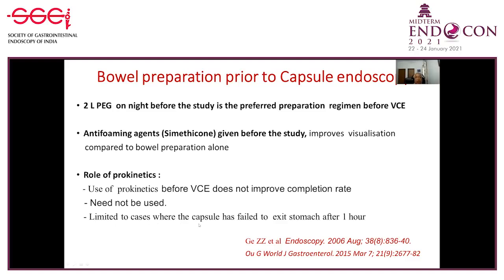It need only be used when the capsule has failed to exit the stomach after 1 hour. So at that time, it may be useful to give a prokinetic.